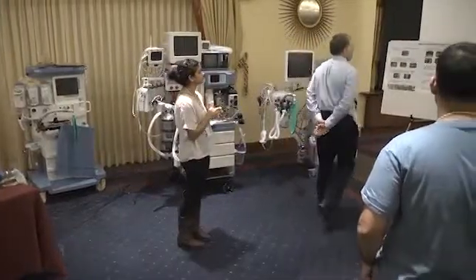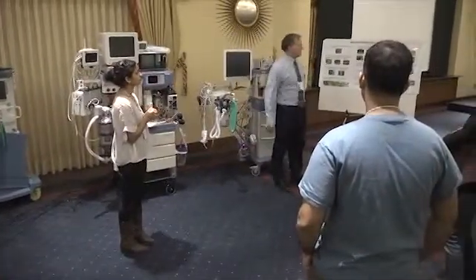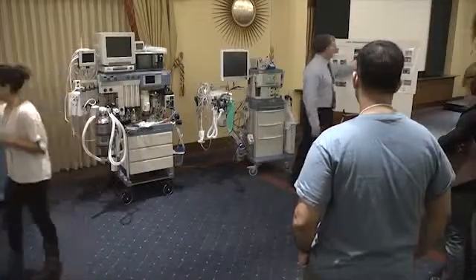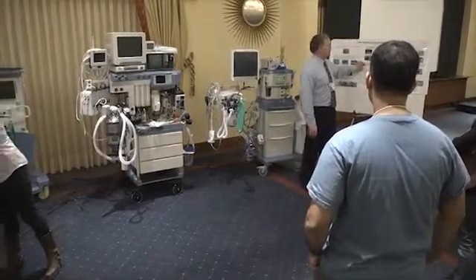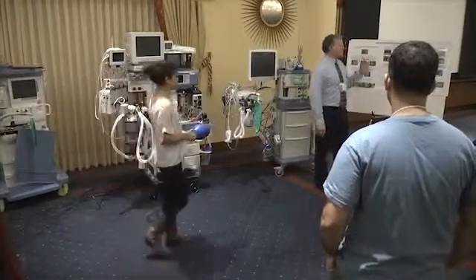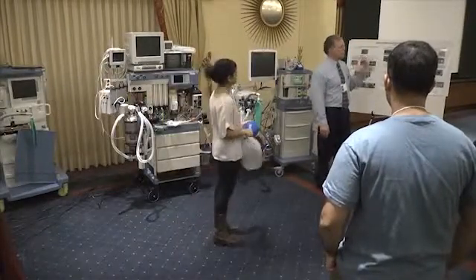So now we're going to go to the ambu bag, and this is, like I said, I think really the most important out of all these tests. This step right here is the one thing that you can't miss, because this is going to save you. In my 25 years, I can say there's been about 6 times when the operators really needed it.